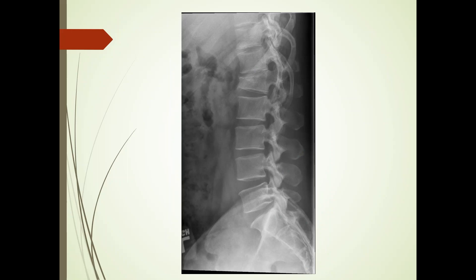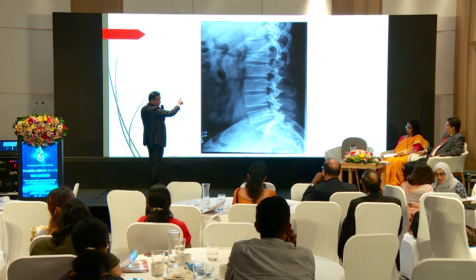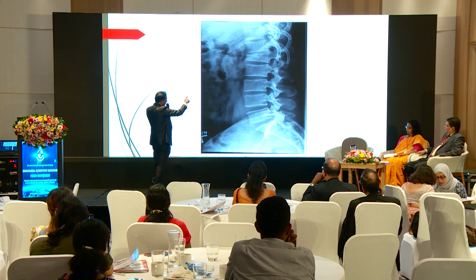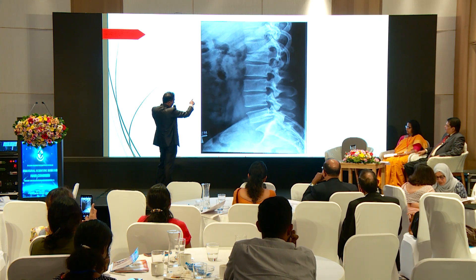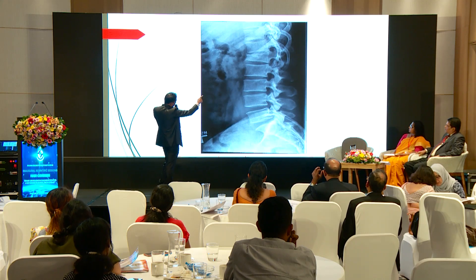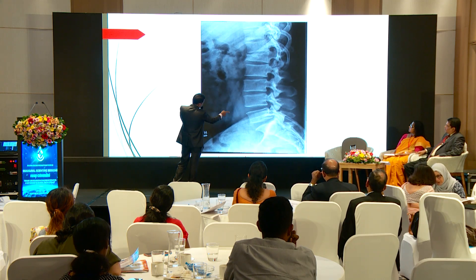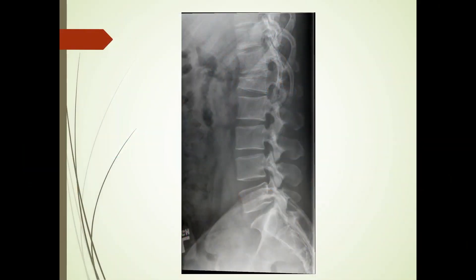In a straightforward case, going through the systematic approach: alignment shows slight straightening of the spine. Then examining vertebral body height reveals reduction of the L1 vertebral body height, predominantly anteriorly, with slight disc space reduction at that level while other levels are normal. Posterior elements are intact. This is an L1 wedge compression fracture — it may be due to osteoporosis or secondary to trauma.